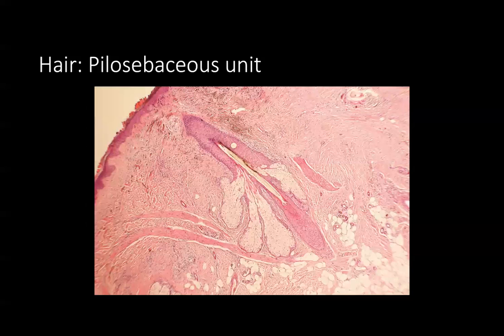All right, so here's an example of a pilosebaceous unit. You can see very nicely the adipocytes extending off. Sorry, not the adipocytes. The adipocytes are here. The sebocytes extending off into the sebaceous lobule. And they produce oil, which goes into the follicular ostia and out to the outside surface of the skin, providing that oil to the skin.